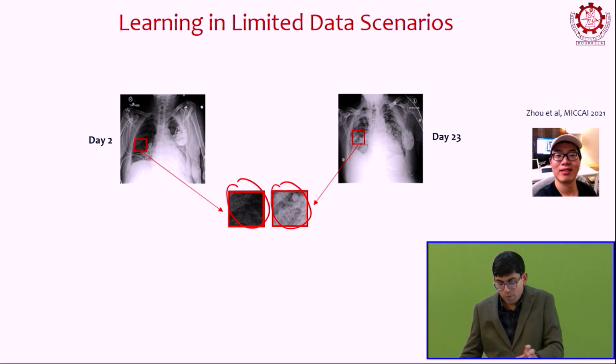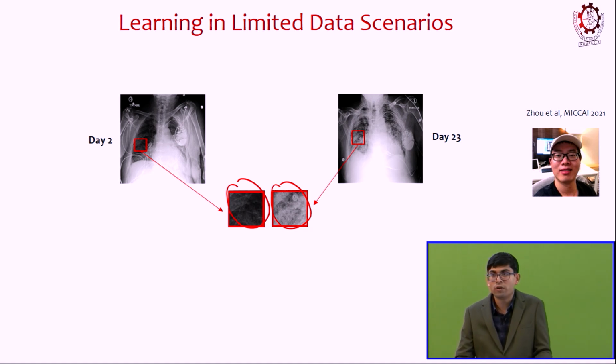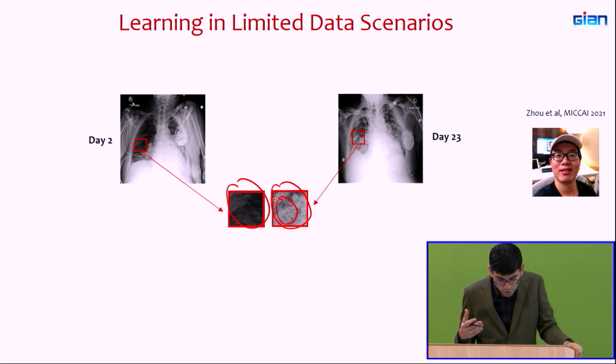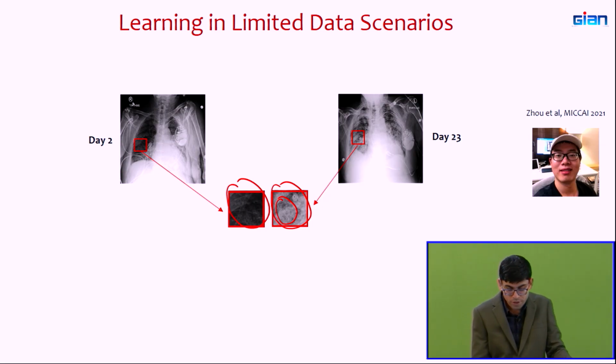So over time the texture of the lung tissue changes. We learned a lot about texture in the first lecture. Clearly the texture is different. If you apply the collage features, or some Haralick features, some filters, you'll see that the responses you get will be very different from the dark region compared to the brightish region. I mean, it's not really a brightish region. You see that there's some sort of salt and pepper like thing here, right? So you see that the texture is very different.